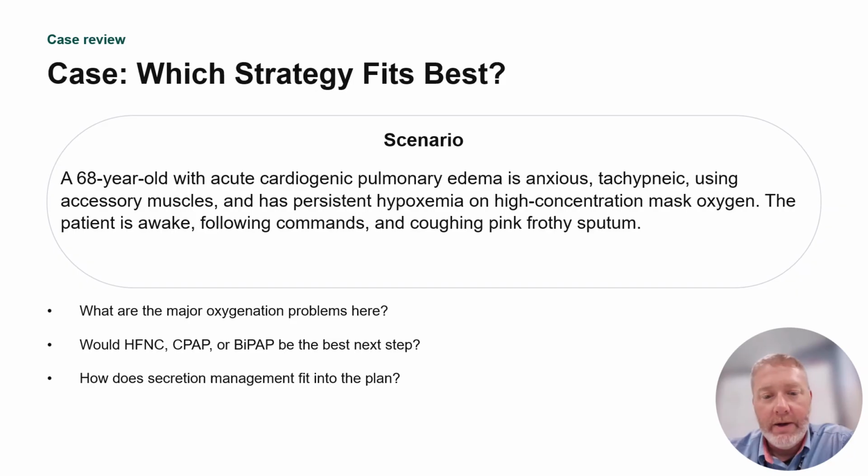As that happens, as the fluid goes off the lungs, as the lungs inflate or expand better as a result of the CPAP PEEP, gas exchange should improve, work of breathing should improve, everything should kind of improve.